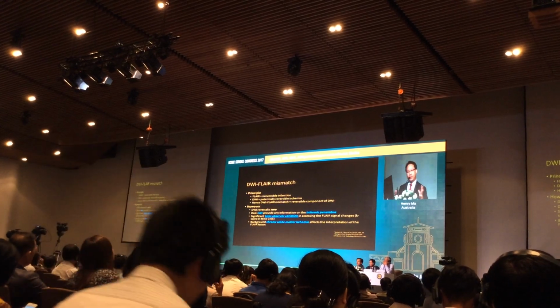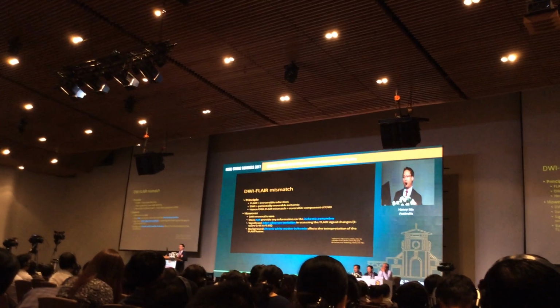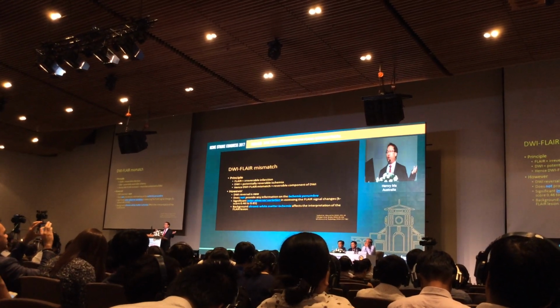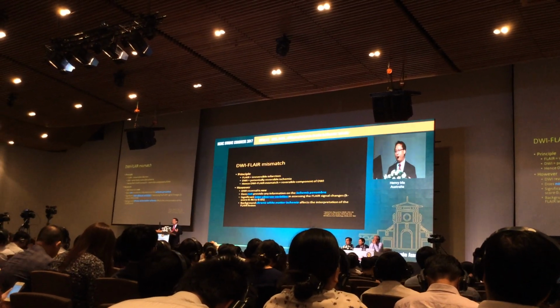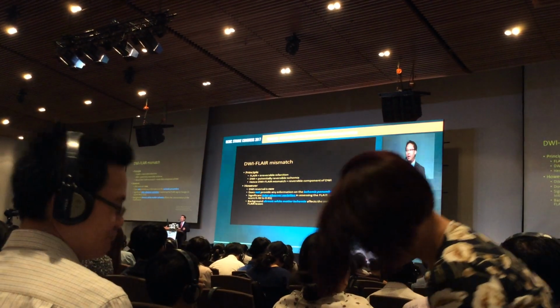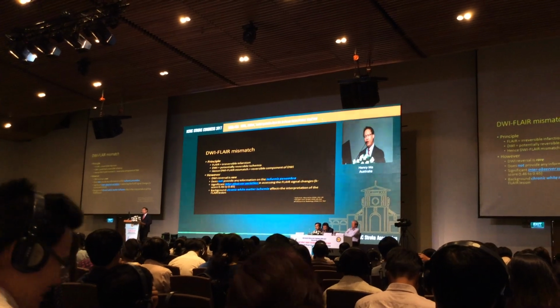So, as I mentioned, it's based on the principle that the FLAIR is infarcted, DWI reversible, but it misses the penumbra. The real problem also with DWI FLAIR is how bright the FLAIR needs to be to be real or not. So the inter-observer variation is quite high. You're looking at a Kappa score of 0.46 to 0.65. And with patients with a massive amount of chronic white matter ischemia, it's hard to tell what is new FLAIR and what is old FLAIR changes. So there's a lot of variation and it's very difficult to interpret.